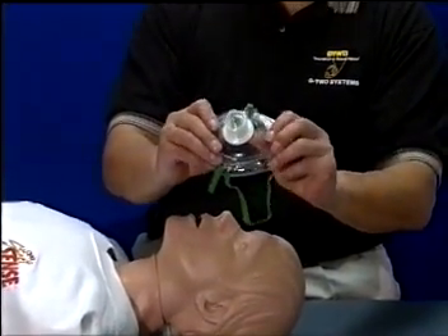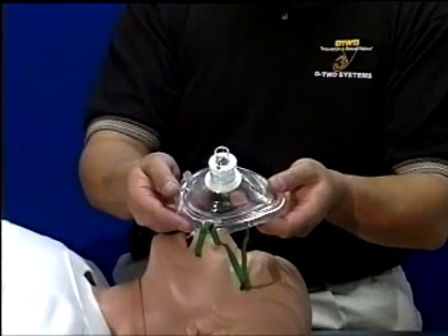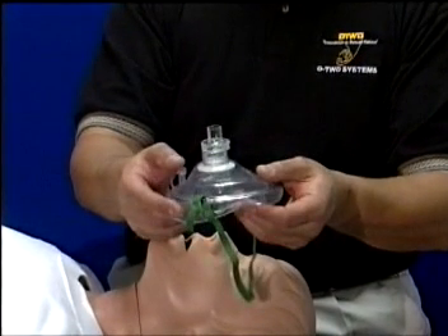Ready for any breathing emergency, the Rescue Breather CPR Universal Pocket Ventilator eliminates the need to carry bulky, cumbersome, multiple-piece, mouth-to-mouth protected devices. Its design efficiently supports single-person resuscitation efforts.